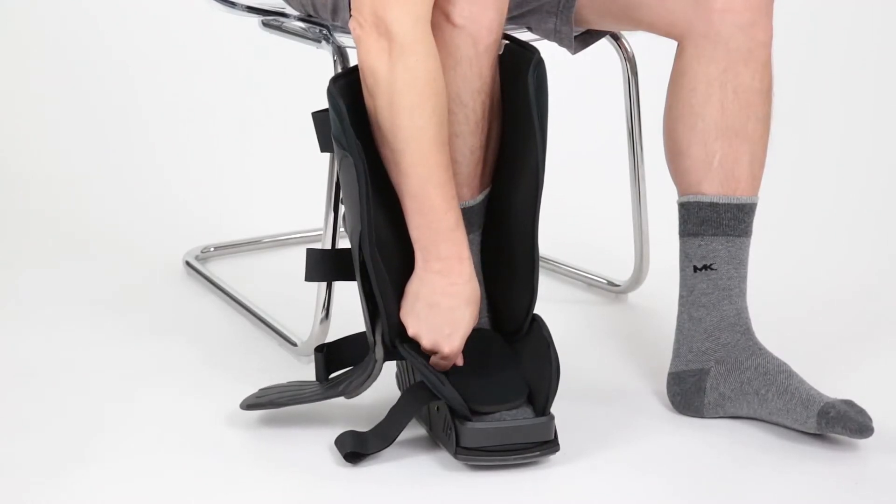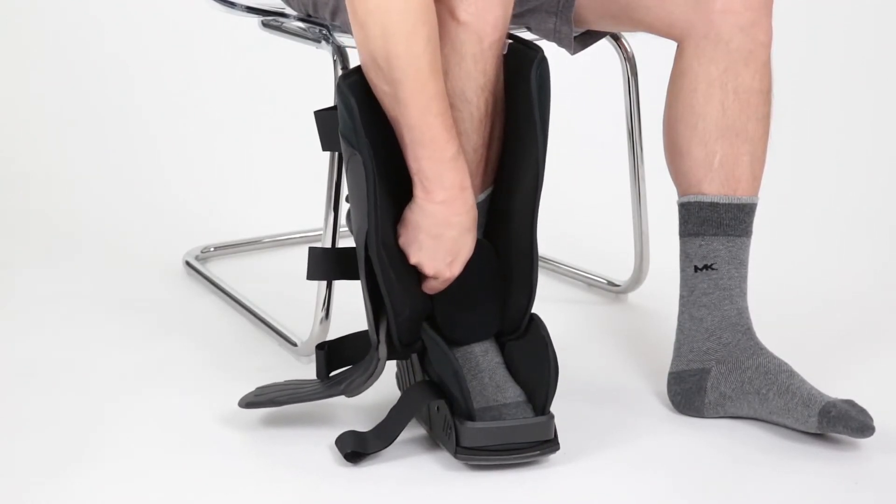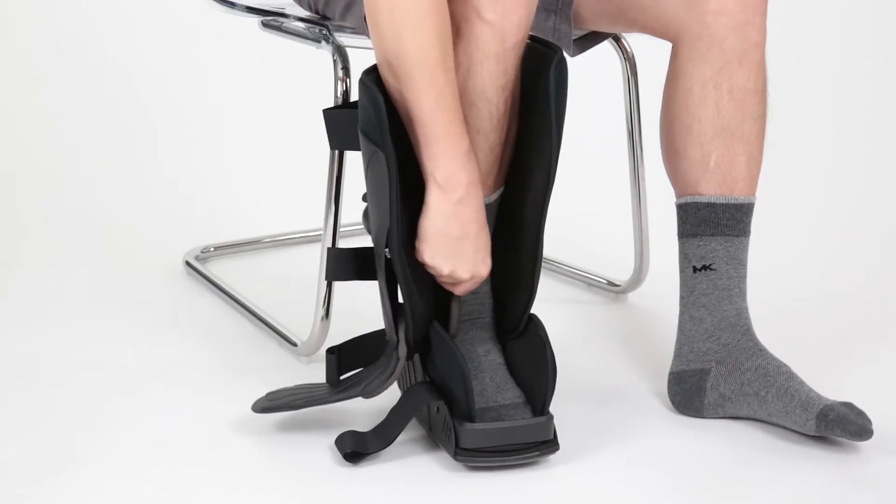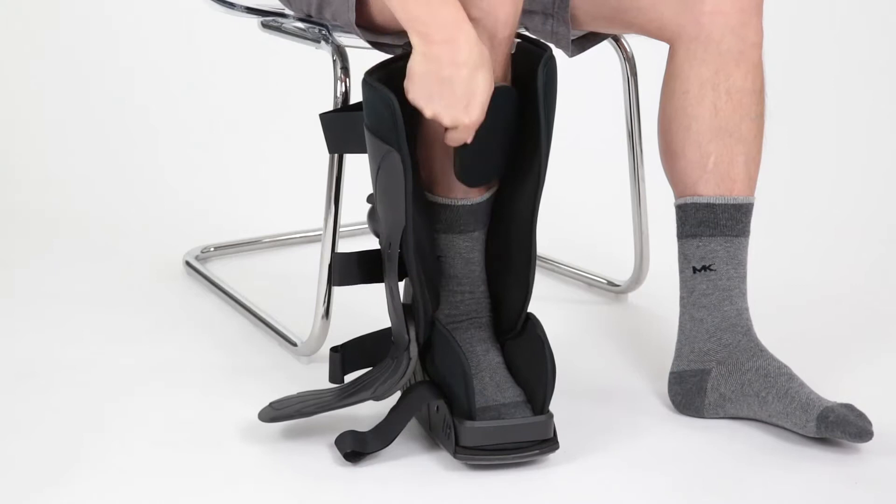Two extra pads are included to cushion the inside of the liner. They can be used around the ankle, the calf, under the foot, or under the straps.